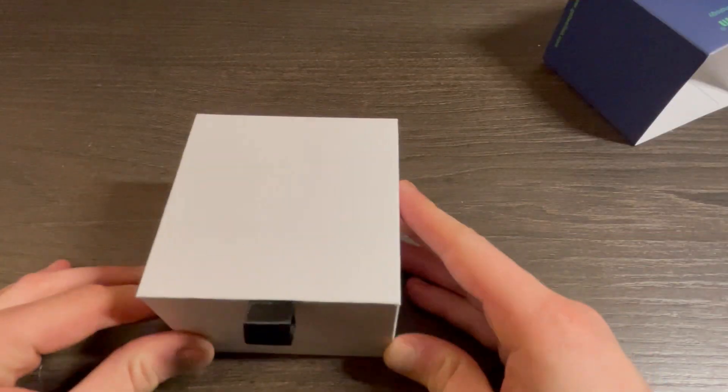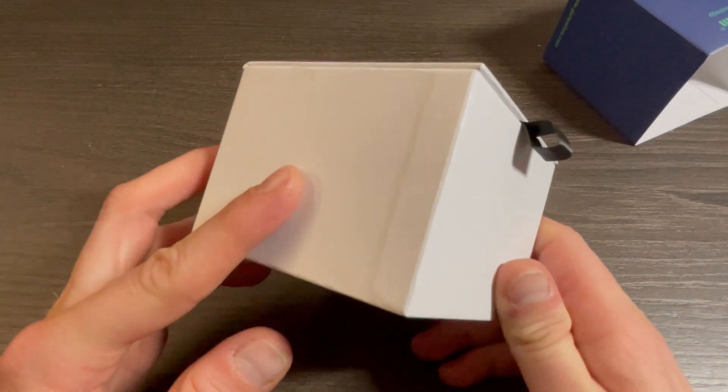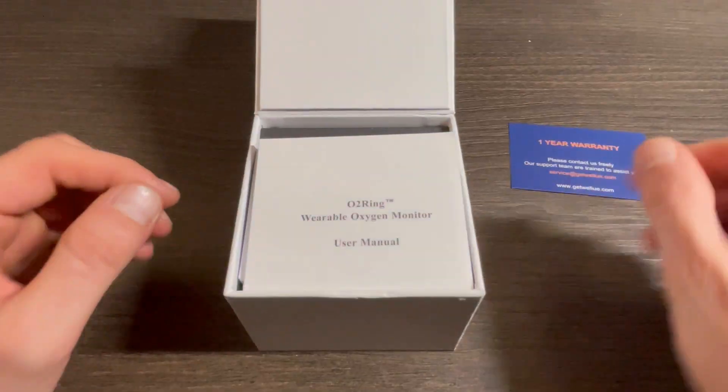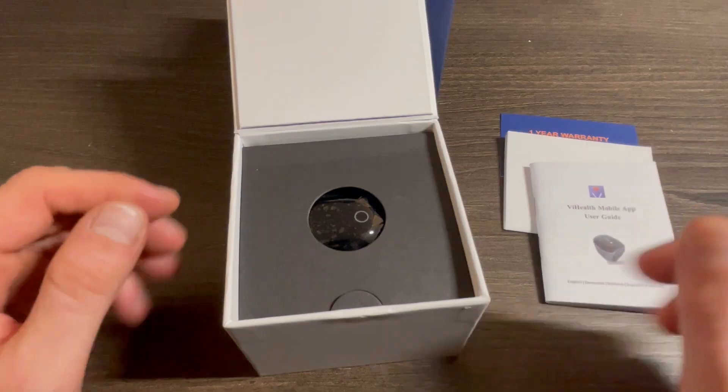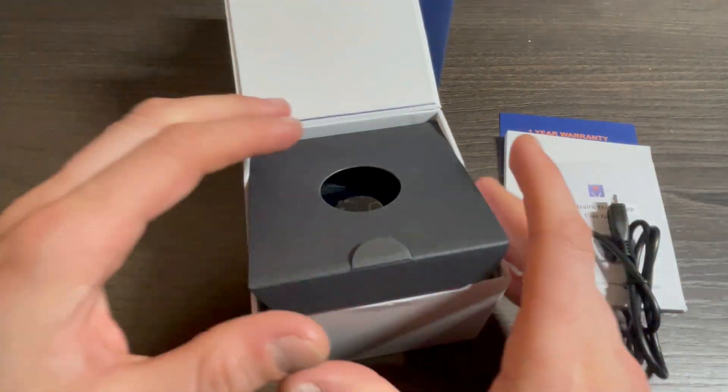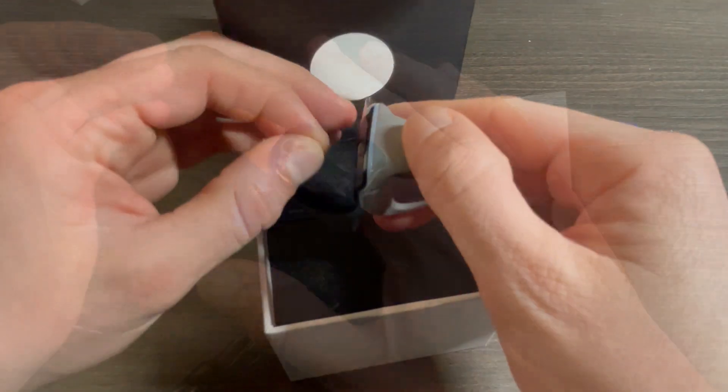The packaging is neat and quite simple. Slide off the outer sleeve and a white unmarked box is revealed. Open the lid by tugging on the black string — you're met with a warranty card, fold-out user guide, and manual. On the side there is a micro USB cable for charging the ring, and here is the actual ring.